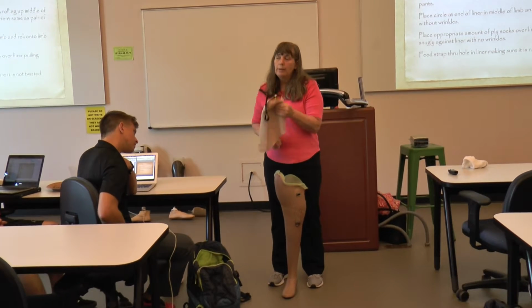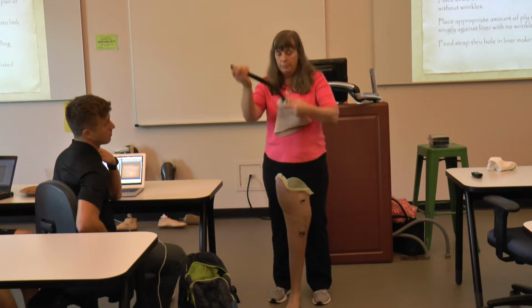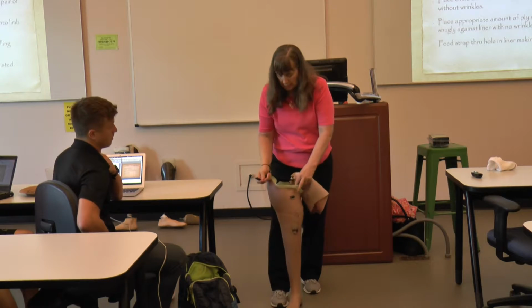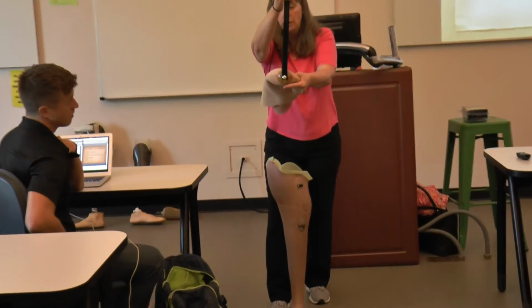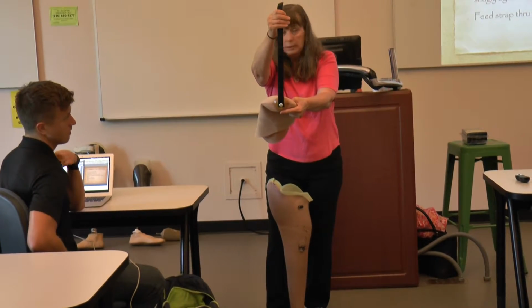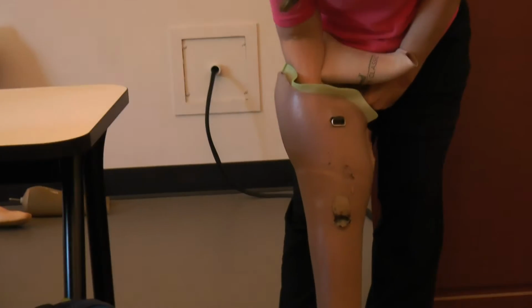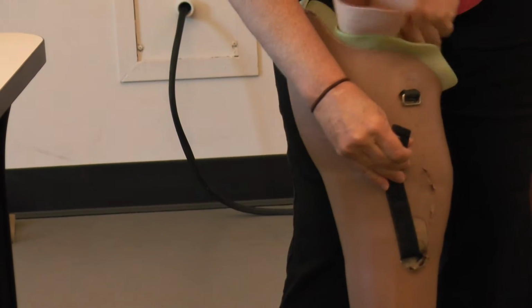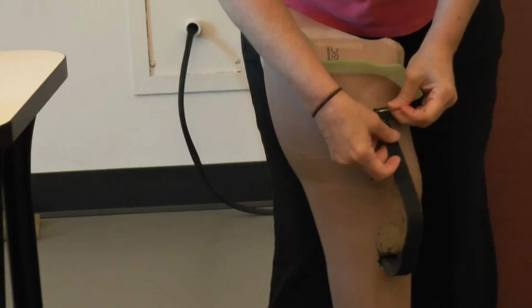Now, there's no way with this system to get this strap tight while sitting, and you can't see. So the patient's going to have to pinch it about an inch back. Make sure it's not twisted. You see how I know it's not twisted? You're actually going to feel for the hole and poke the strap out of the hole and then grab it. You're going to tighten it up as tight as you can while sitting.